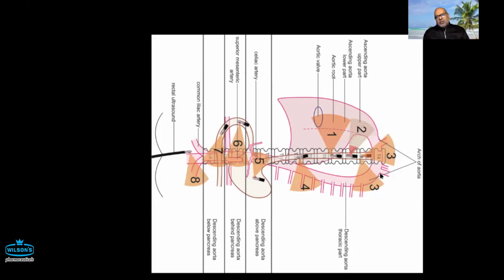And so actually you will see the subclavian first, and then you will see the common carotid, and then you will see the aortic arch. And if you keep on rotating, then you will see the azygos vein. So if you rotate it anti-clockwise, you're going to actually see posteriorly. So that will actually help you.